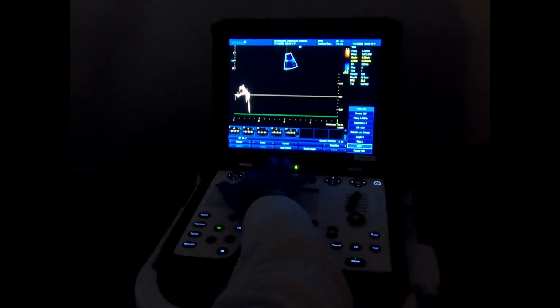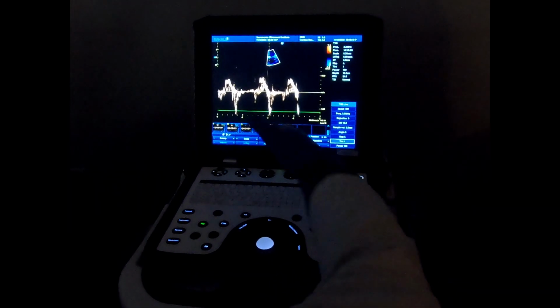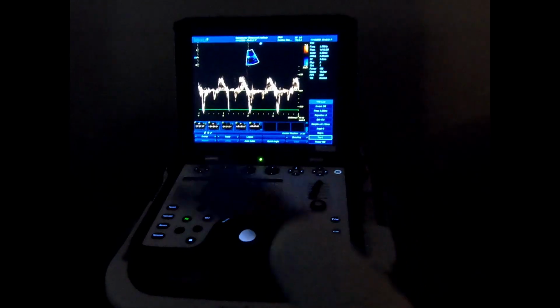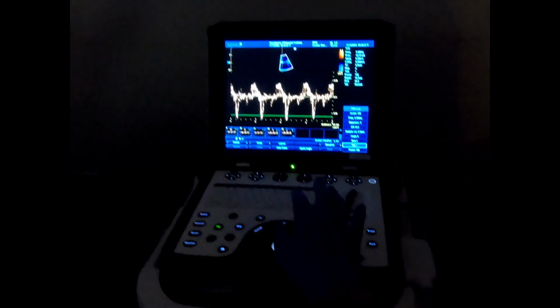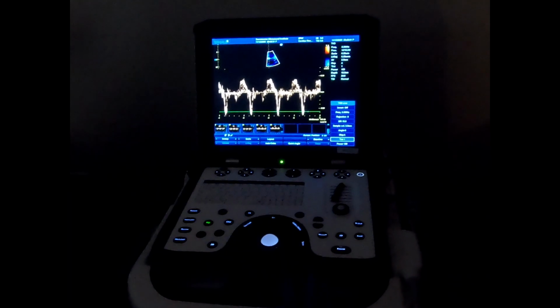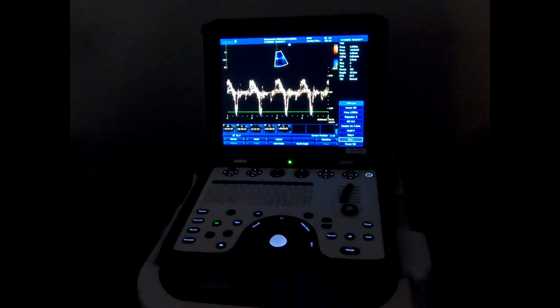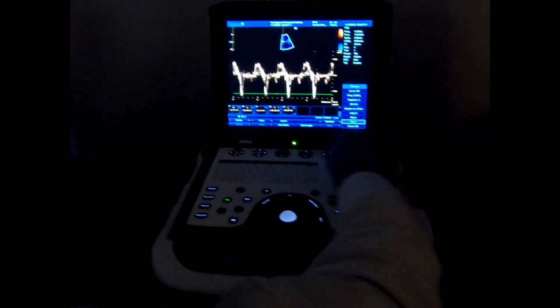All TDI is pulse wave. I was with the manufacturer to discover this the day we got these machines. I asked for this function, and then we read the instructions. So it's a combination of multiple keys. Okay, so changing the baseline.